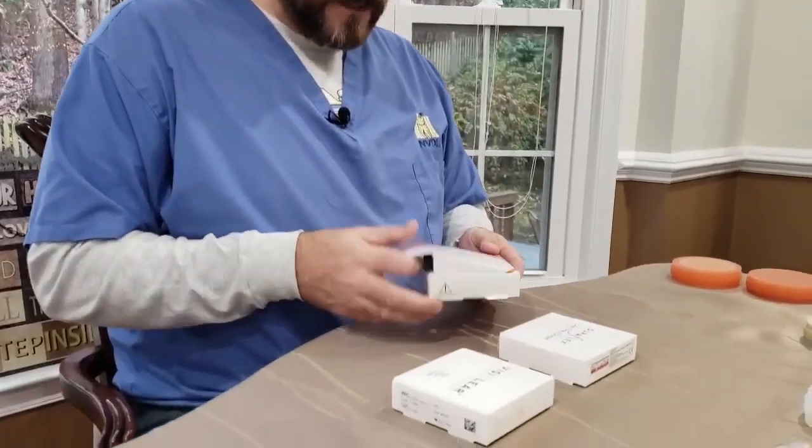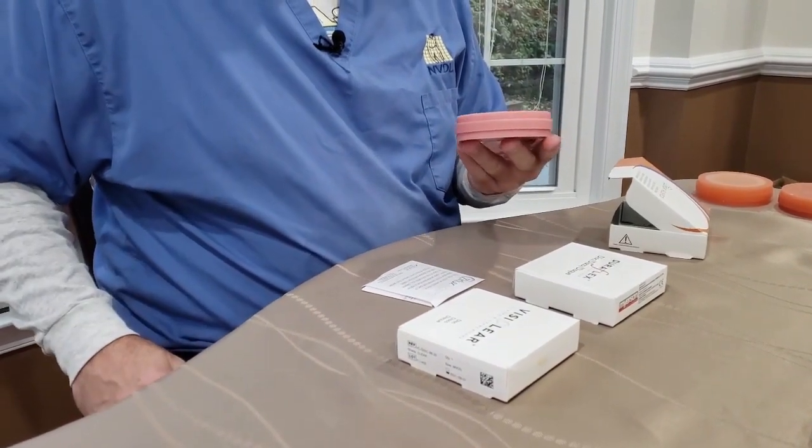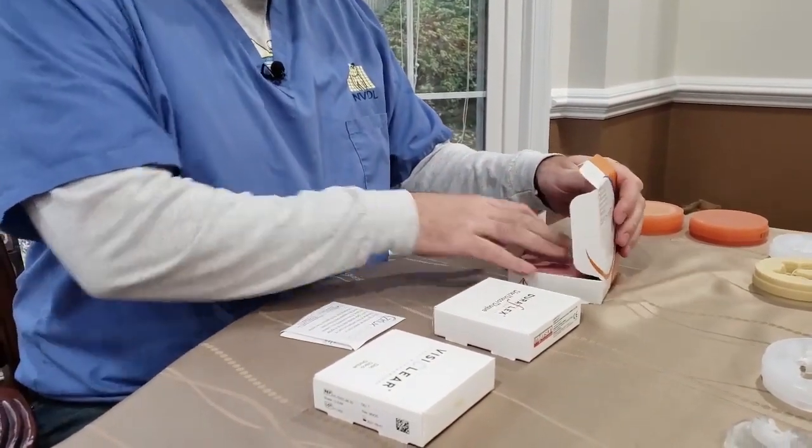I'm going to start out with the Xurlux Acetal. It comes in tooth color — bleaching shade B1, A1, A2, A3.5 — and a pink shade. This material has some stiffness to it and can be more traditionally designed. It's probably our most universal material because you can do flexible clasps, partial frames, unilaterals, bite splints, and crown and bridge cases. It's very strong — 8 to 10 times stronger than PMMAs — and it doesn't absorb any moisture.